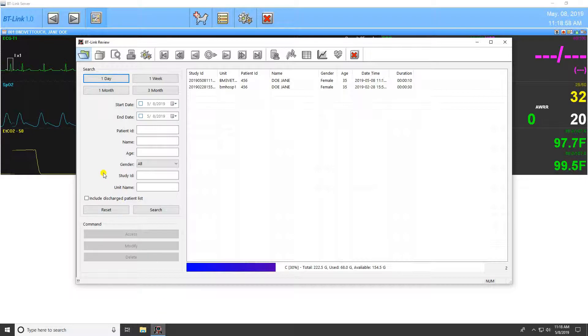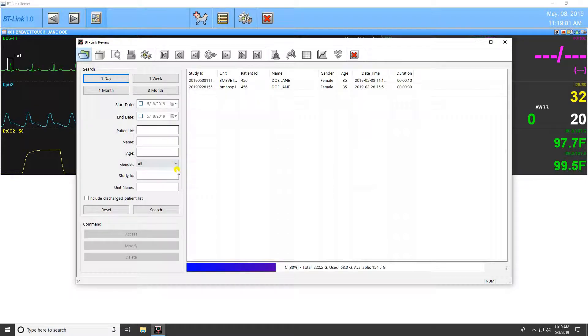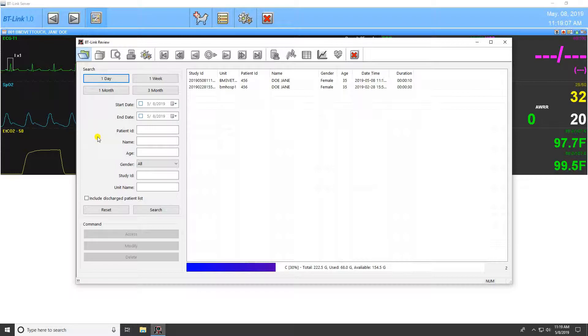From this main menu, you can search for patient data from the saved database on your computer. Currently admitted patients will automatically display in the selection field, but discharged patients can be displayed as well.